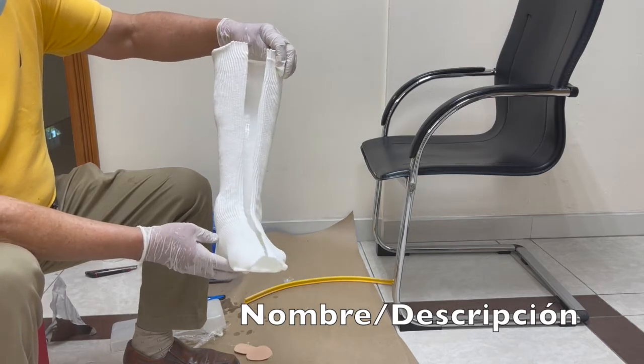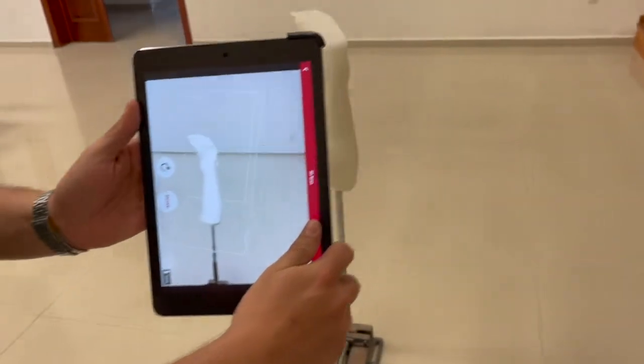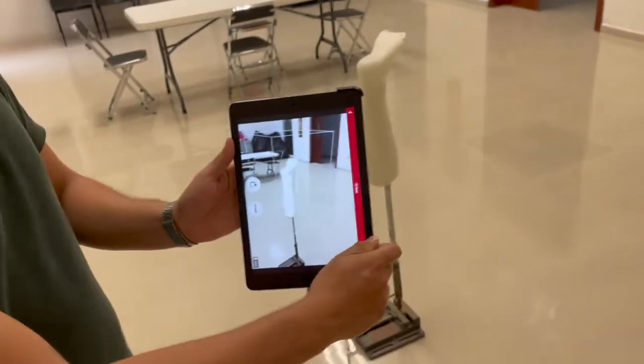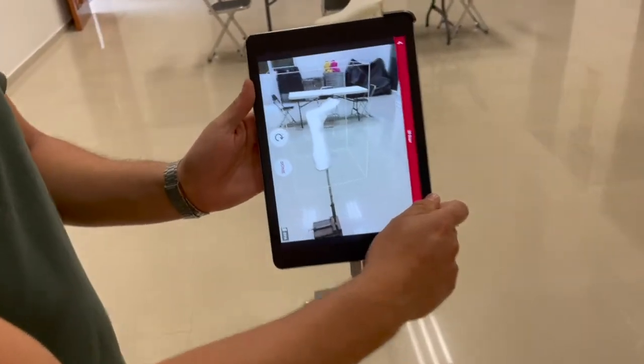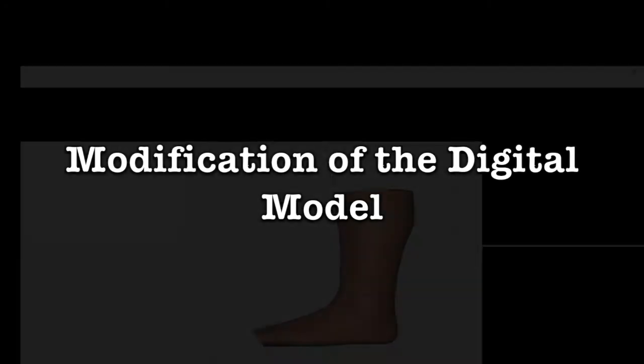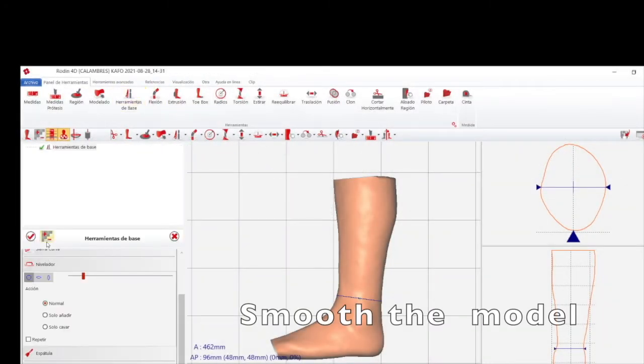Here you can see a good definition of the model of the cast — so nice. Once we have this we can scan the cast. You can see it's about a minute, and with practice it's very easy to scan it.